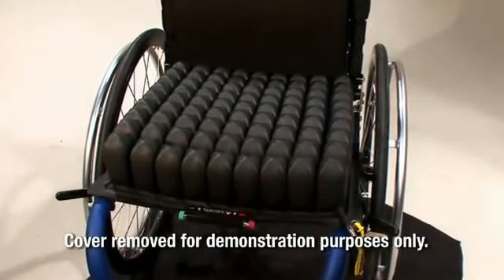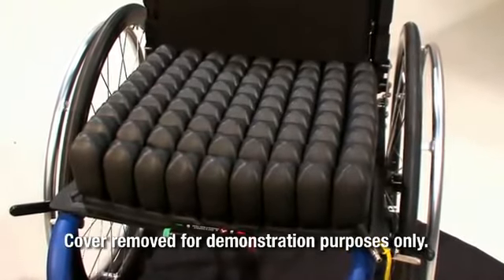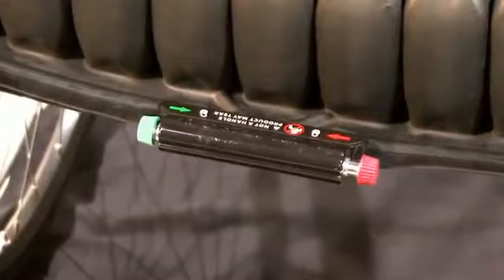The Quattro Select cushions are divided into four quadrants, or chambers, that allow you to control the arrangement of the air within the cushion. The isoflow memory control on the front center of the cushion is what allows this.